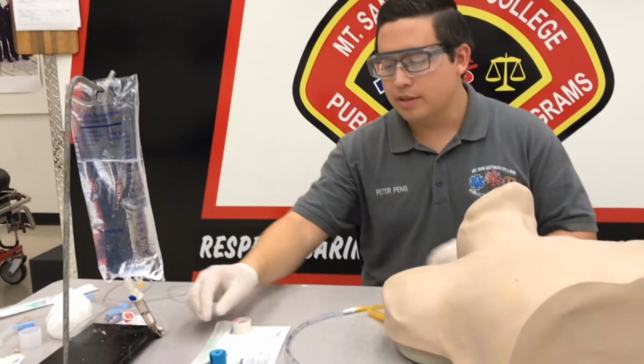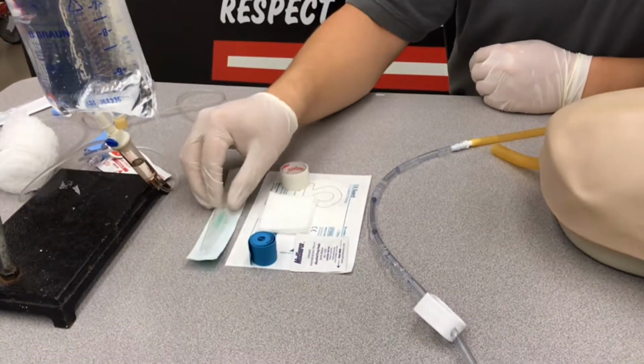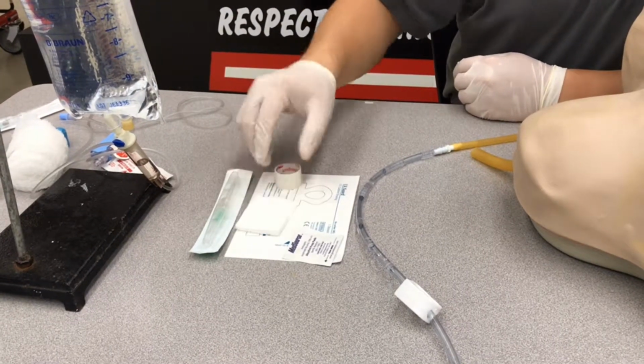And the rest of our equipment, we have an 18 gauge IV catheter. You want at least an 18 or bigger if possible. We don't need our constricting band, so I'll set that aside. We have an alcohol prep pad, some gauze, some tape, which I have a few pieces already. Set up the rest of our equipment here.